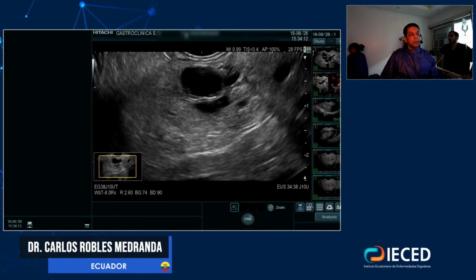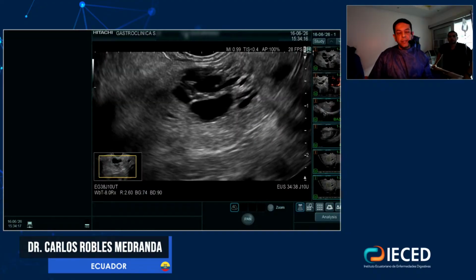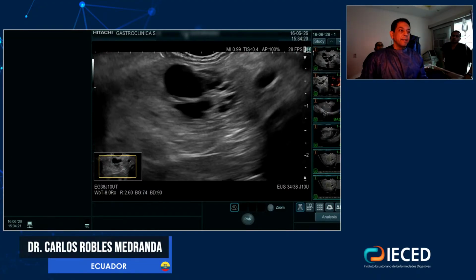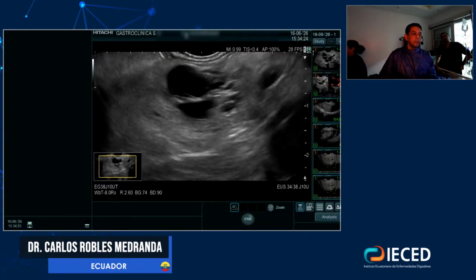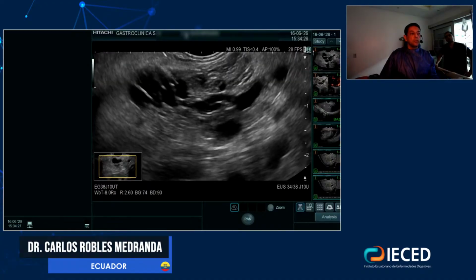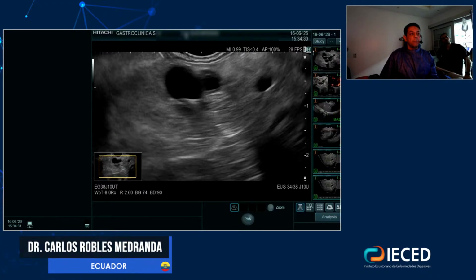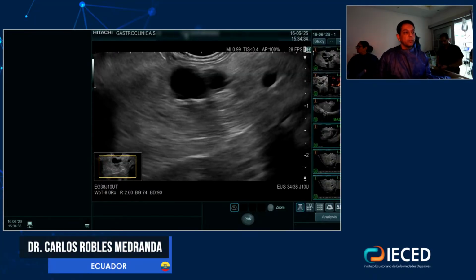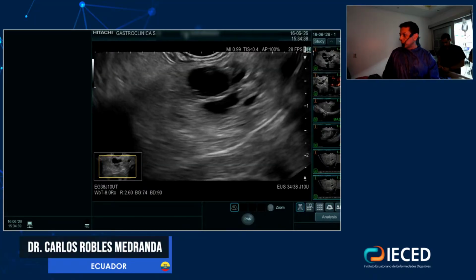Yes. So Juan Manuel is asking me why I will use two needles. Well, I believe there is a component of the cystic lesion that is combined. Sometimes you can have two different lesions, and it appears that it's just one. So I believe it's important to do it, to have tissue and a correct diagnosis for this patient. So I want to share this case with you today.